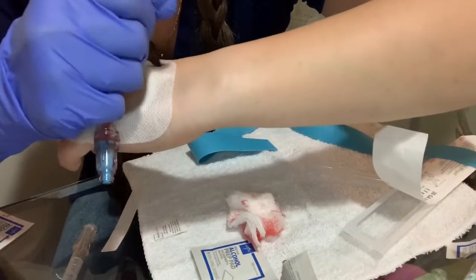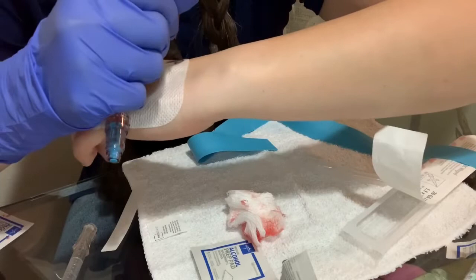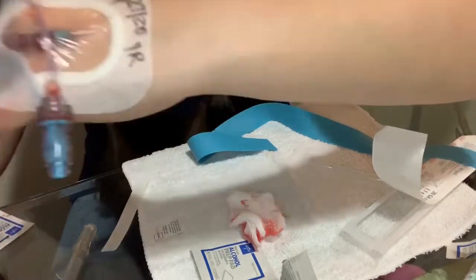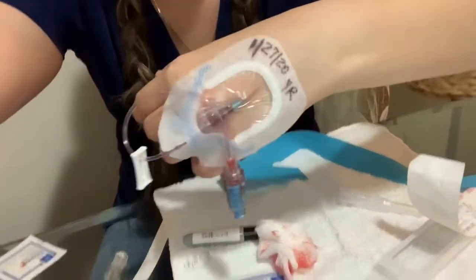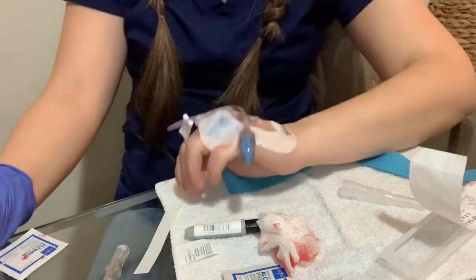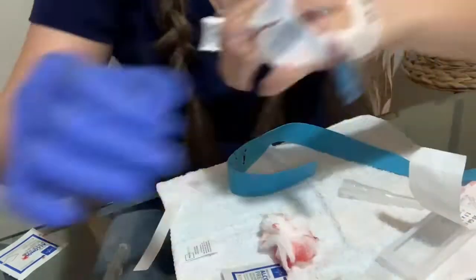The last step is to get a Sharpie and put the date, the time, and your initials. In this case I used a 22-gauge because my vein is a little thin. You have to be very careful to use the right needle for the right vein.